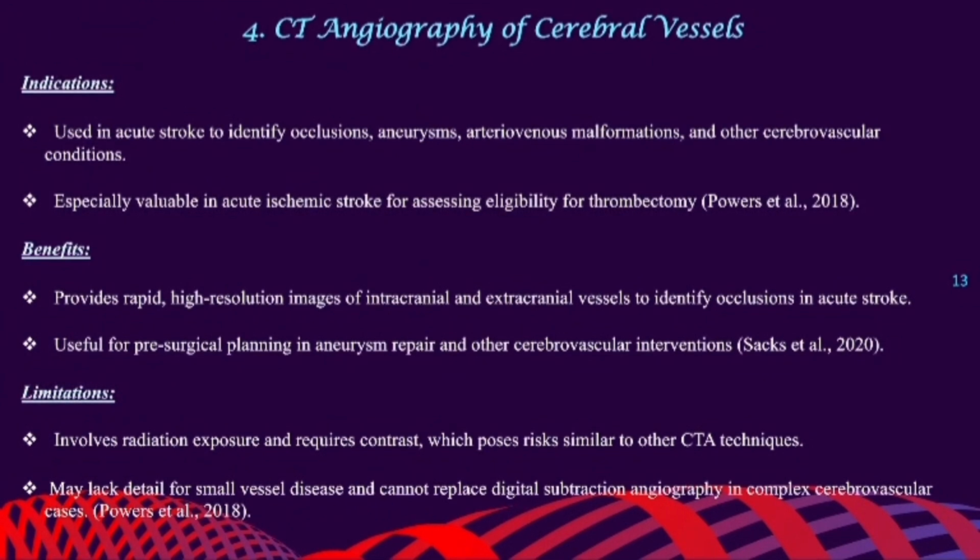CT angiography of the cerebrovascular vessels is used in acute stroke to identify occlusions, aneurysms, arteriovenous malformations, and other cerebrovascular conditions. However, it requires radiation exposure and requires contrast, which poses risks similar to other CTA techniques.